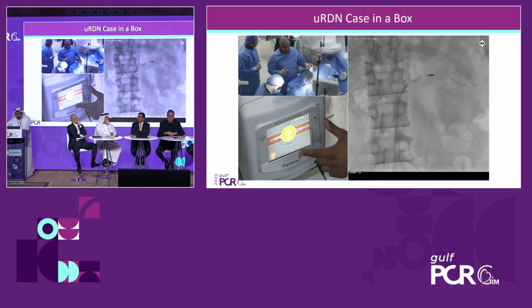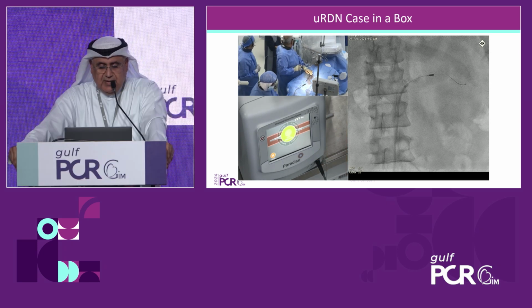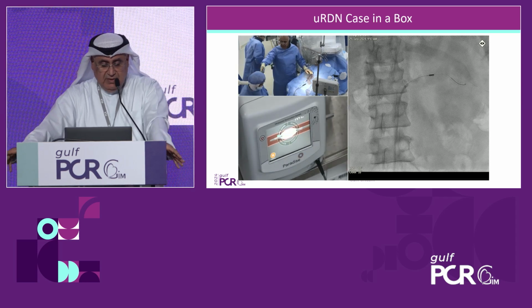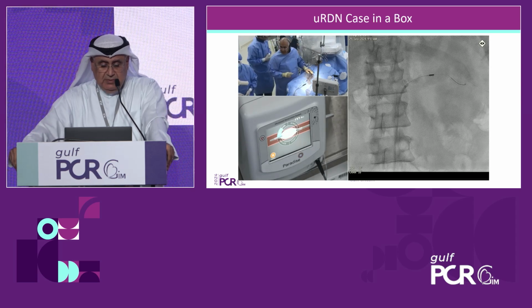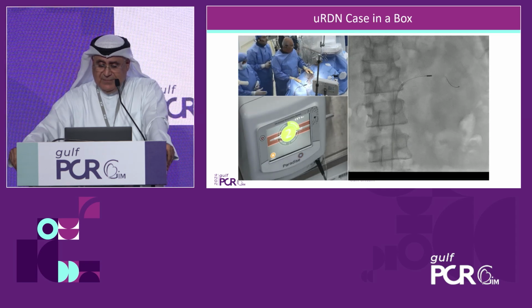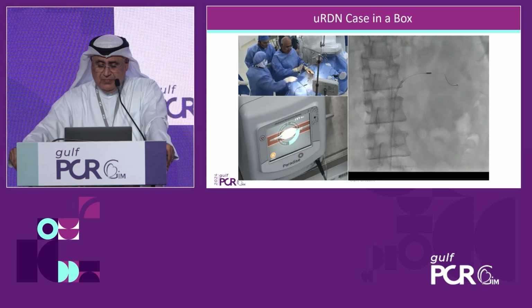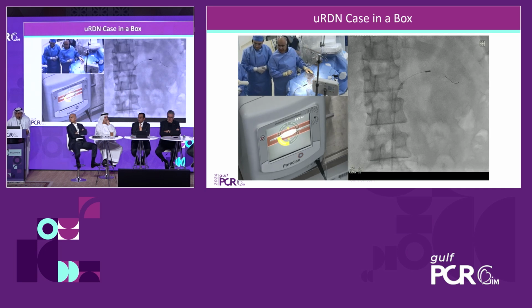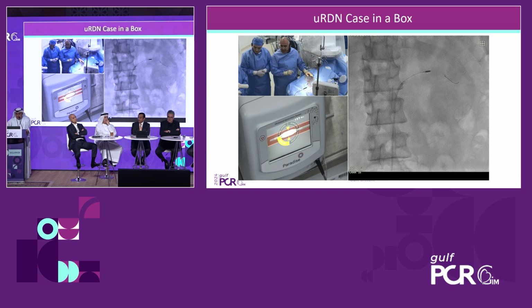Now we are asking the anesthetist to give another shot of painkiller, because the patient will start moving actually. It's expected. We had experience also with the RF technology. We have exactly the same. So it is really some kind of painful procedure for someone who tried it. Patient's moving a bit. Our anesthesia is giving some more painkiller. We see the movement on the left side, the patient's moving his legs. But they sense this. And now deflating the balloon again.